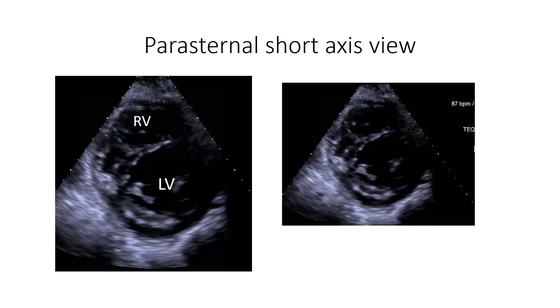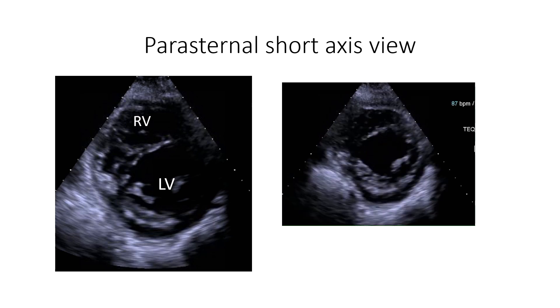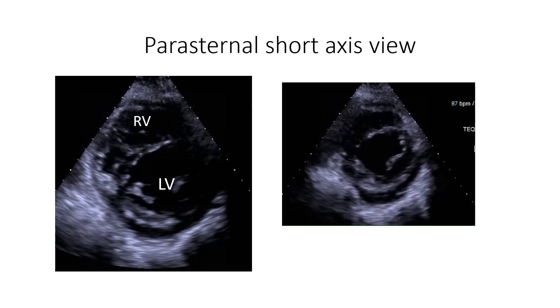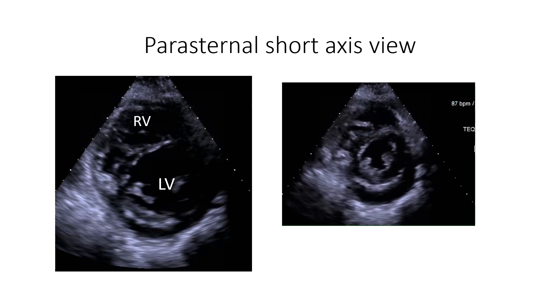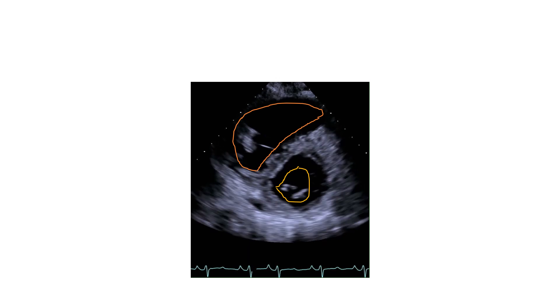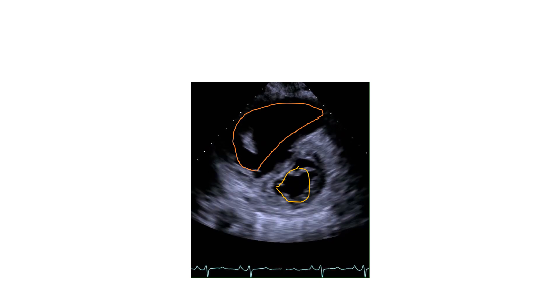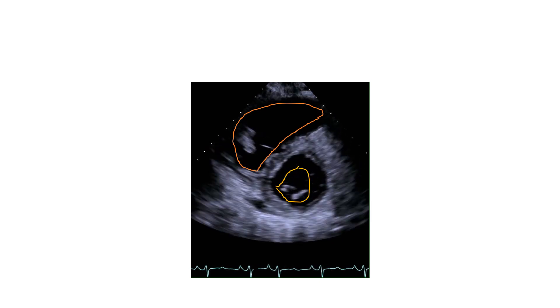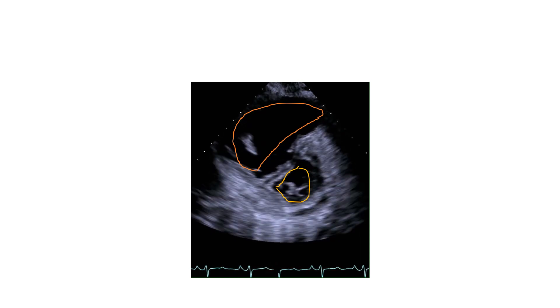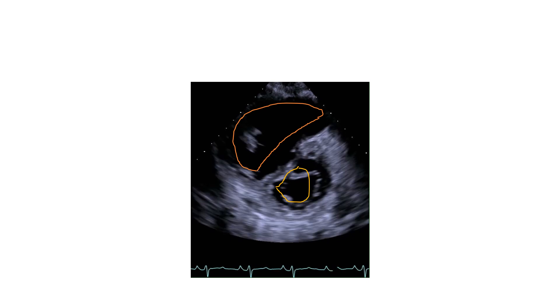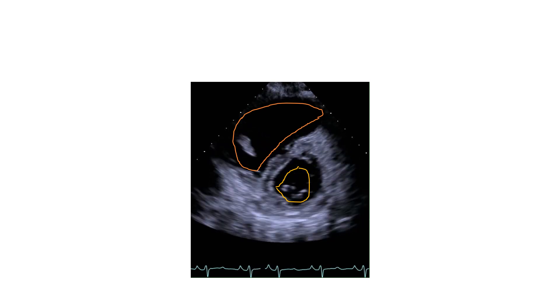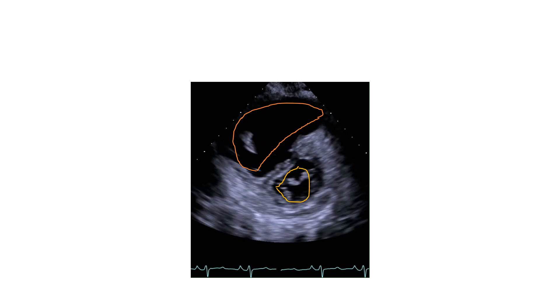These images show the parasternal short axis view with the right and left ventricle; the interventricular septum is visualized between them. The left ventricle is normally circular in shape and larger than the right ventricle. In this view, we can see ventricular interdependence — high pressures in the right ventricle push the septum towards the left ventricle, compromising its diastolic and systolic function. Note the D-shaped left ventricle and the dilated right ventricle.